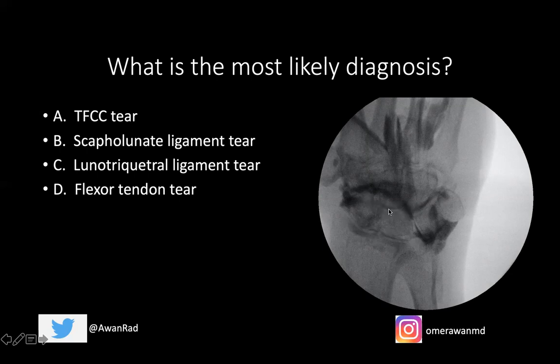The only way contrast can go from the proximal carpal row to the mid-carpal row is one of two ways: there has to be a hole or a perforation in either the scapholunate ligament or the lunotriquetral ligament, because that's the only way contrast can get from the proximal carpal row to the mid-carpal row. If there's a tear in one of these two ligaments — which are barriers between the proximal and mid-carpal rows — you will get contrast extravasation into the mid-carpal row.